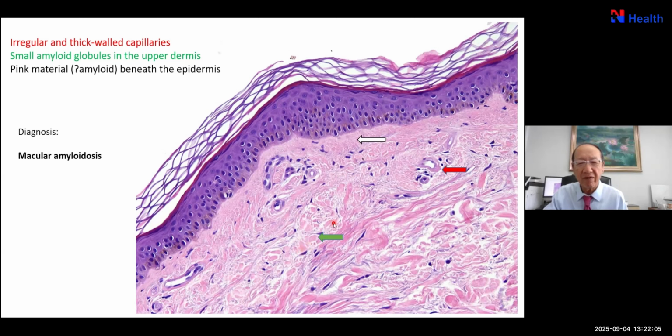They are so irregular, pale pink globules. And the subepidermis is too dense. Usually, the spaces in the subepidermal area are intercellular, and the stroma here is much looser. There's something pink in here. This pink and this pink.